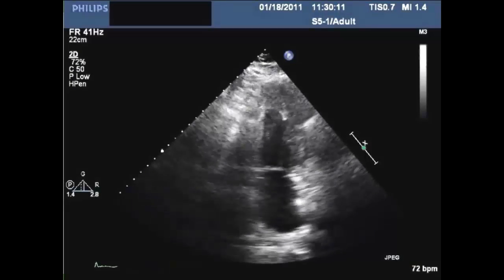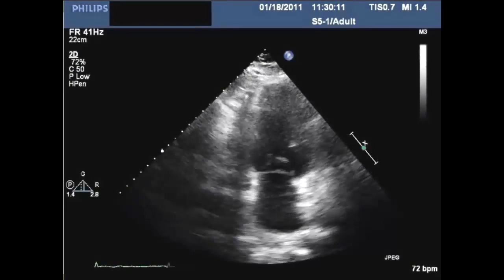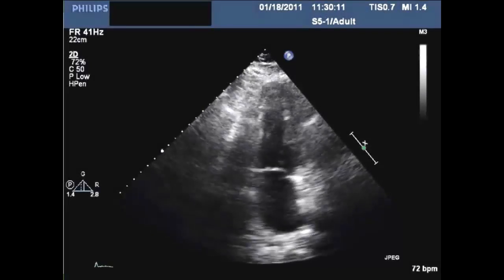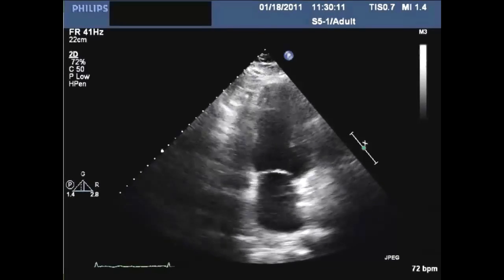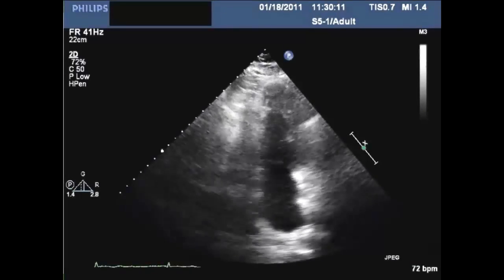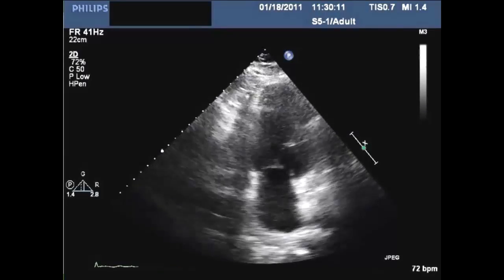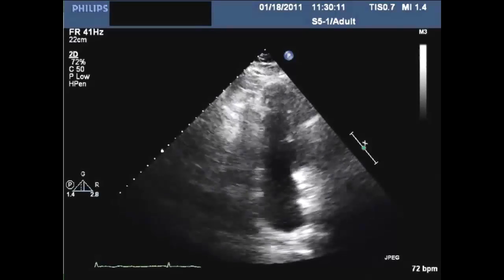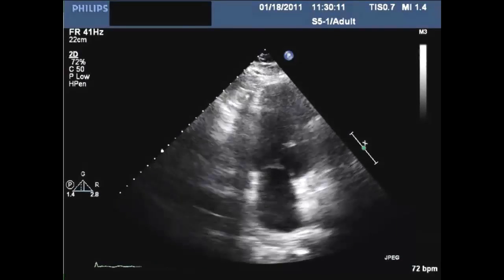These images are not infrequent in our echo labs, right? Now, I couldn't find any resting pictures of the left ventricle on this patient. This is case number 2, because I can tell you what the sonographer was thinking and how I think. When I know I'm going to use contrast at the end of the study, I do not spend extra time focusing on that LV for function and regional wall motion abnormalities. So that's case number 2.